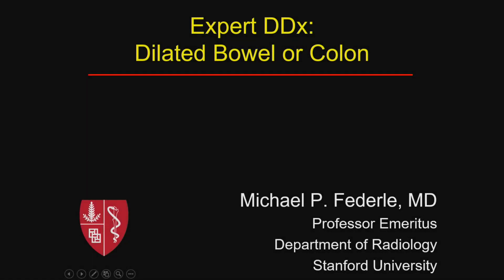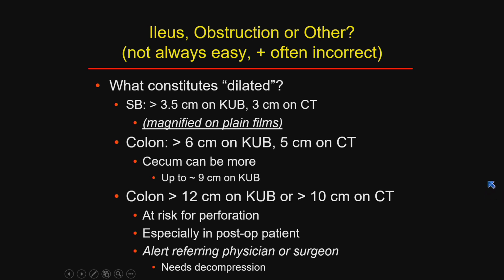So for the last 5 or 6 years at least, I've been focusing my teaching on putting together lectures based on expert differential diagnosis. We find a particular imaging finding or are presented with a patient symptom such as right lower quadrant pain, and I want to help you try to figure out an approach to this that will allow you to provide a specific or a very clinically useful differential diagnosis.